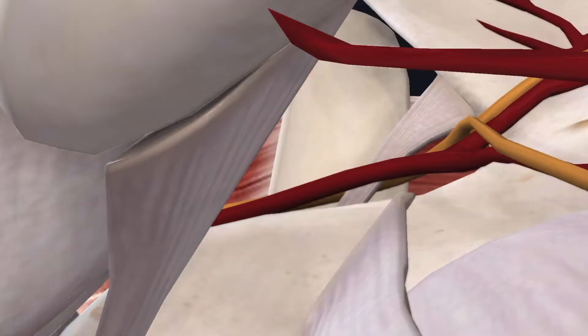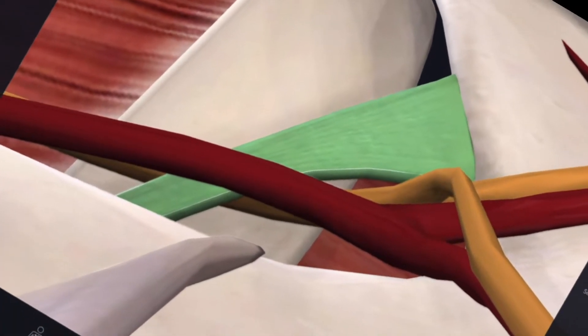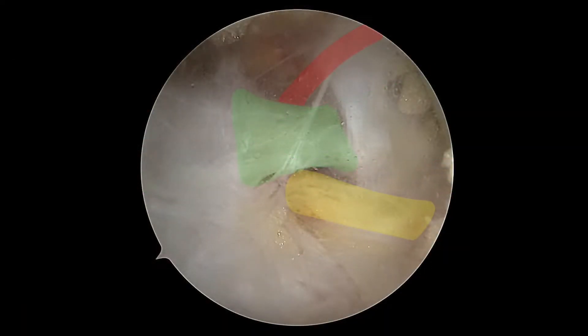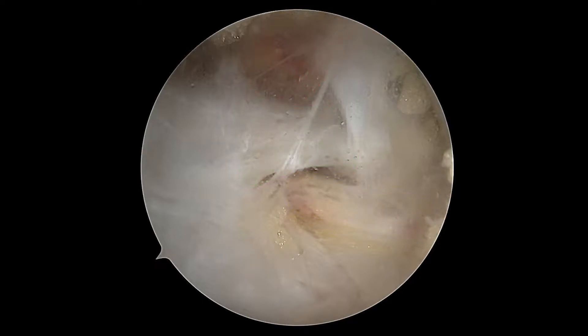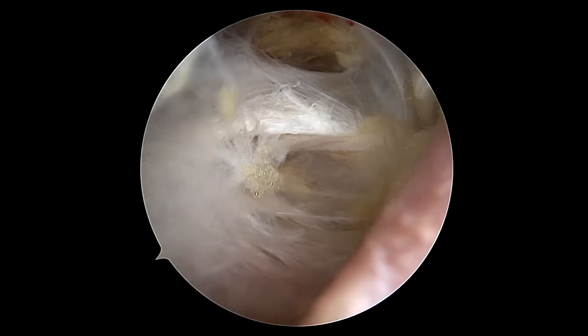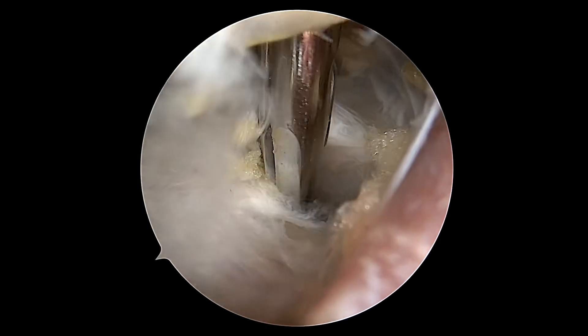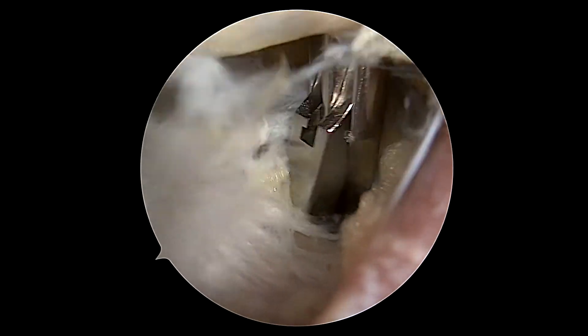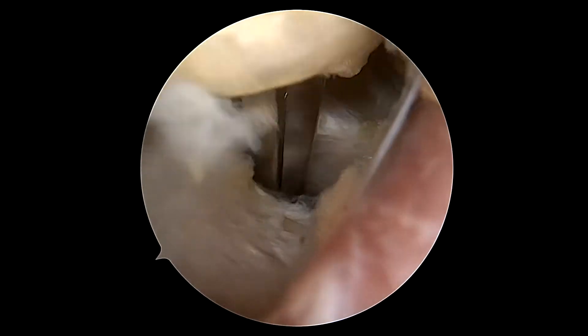Through the animation, we can see where we're going — that green structure is the superior transverse scapular ligament compressing the suprascapular nerve. The suprascapular artery runs above it and the nerve runs below it. Here we're bluntly dissecting to create an area to bite through and release that ligament.